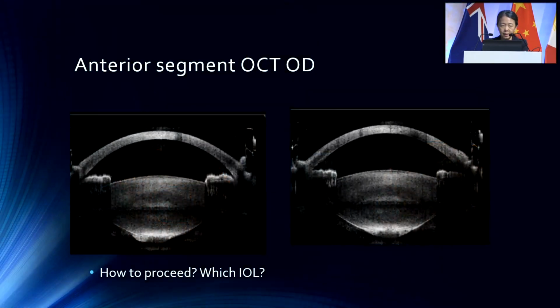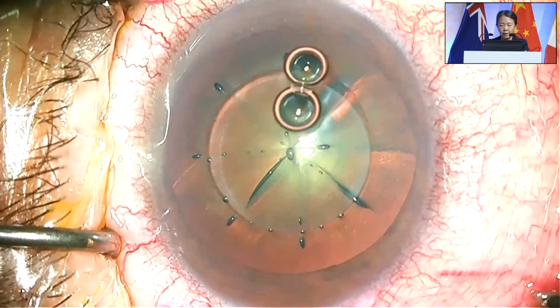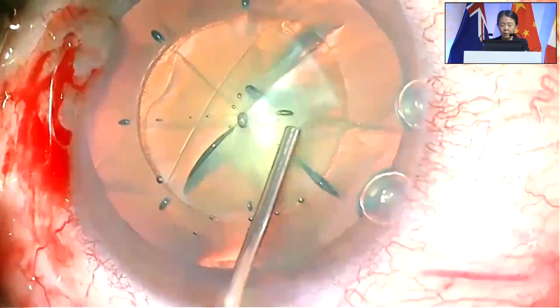When we look at the anterior segment OCT, which Dr. Titiel and Dr. Namrata Sharma have actually taught us, it's very important to do this test, and you will see the type of polar cataract you have here in this right eye. All right, it's already ruptured, for sure. The posterior capsule is discontinuous there. So what lens am I going to offer him?